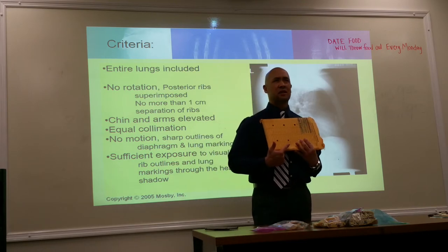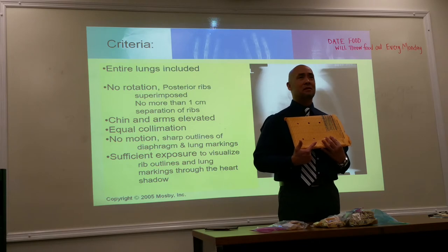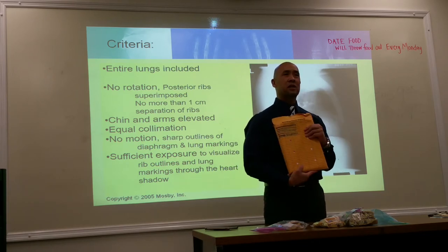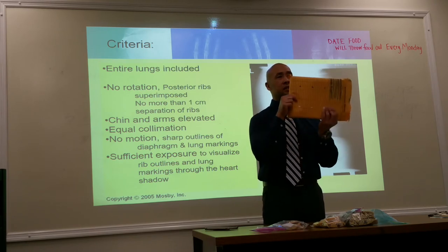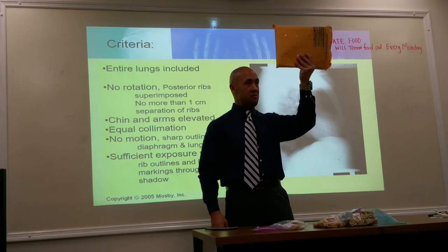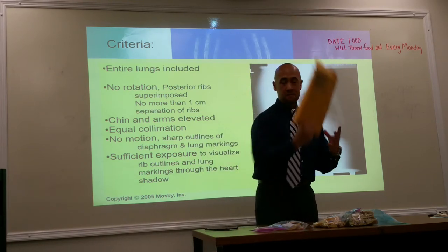What do you guys call this? Landscape? What do you call it, Evelyn? Is it landscape? That's what we're going to say. Okay, landscape. Portrait. This is portrait, right? And then landscape. Is this portrait? Yes. And this is landscape. Okay, so this way for AP or PA. This way for lateral, okay?